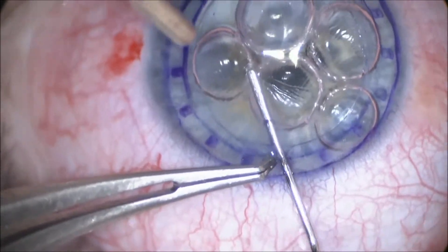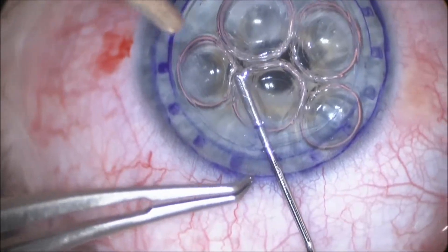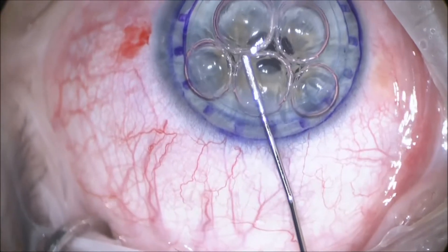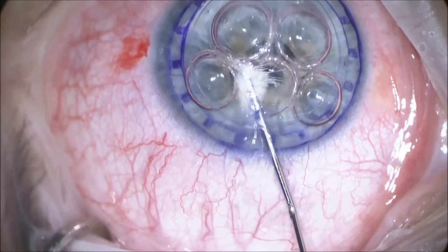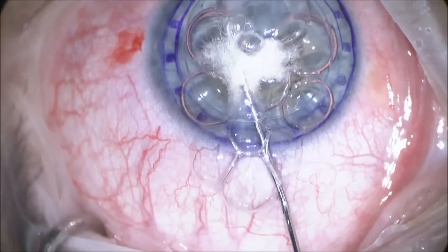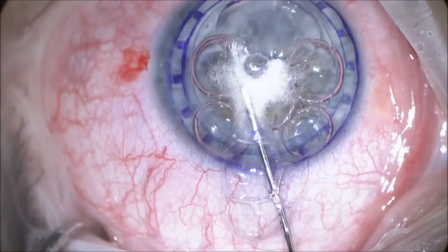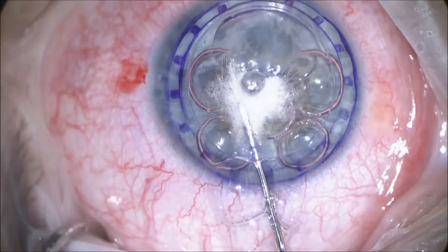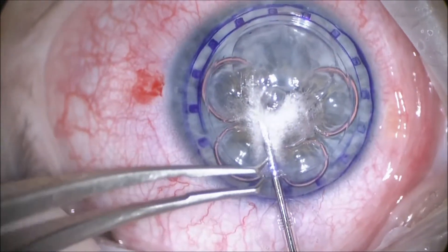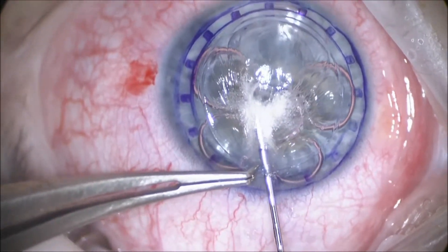And once we have gotten it into the pocket, we start our injection. Now here what you see is a partial bubble that forms at the top of the picture, and you see that the adjacent anterior chamber bubbles are being pushed aside, letting us know that we're having a lamellar dissection.